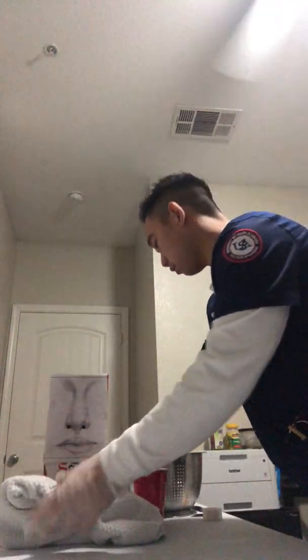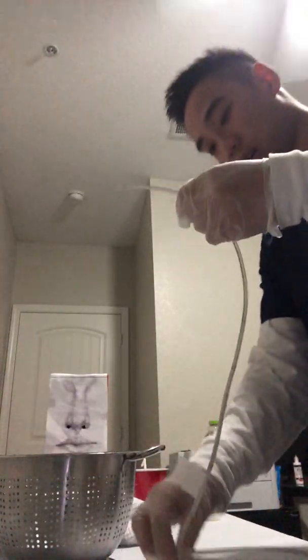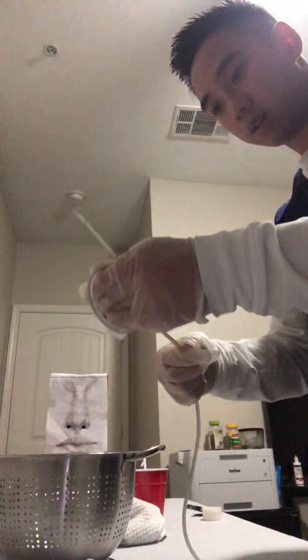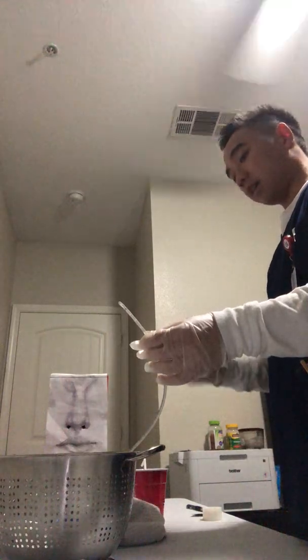After I do that, I am going to place a towel on my patient's chest, basin on the abdomen. I'm going to come over here, grab my tube. I'm going to coil it up like so, and then I'm going to release. I'm going to lubricate the first 4 inches into my lubricant from earlier. Place the tubing into my basin. I have the basin here in case I need to catch any emesis.